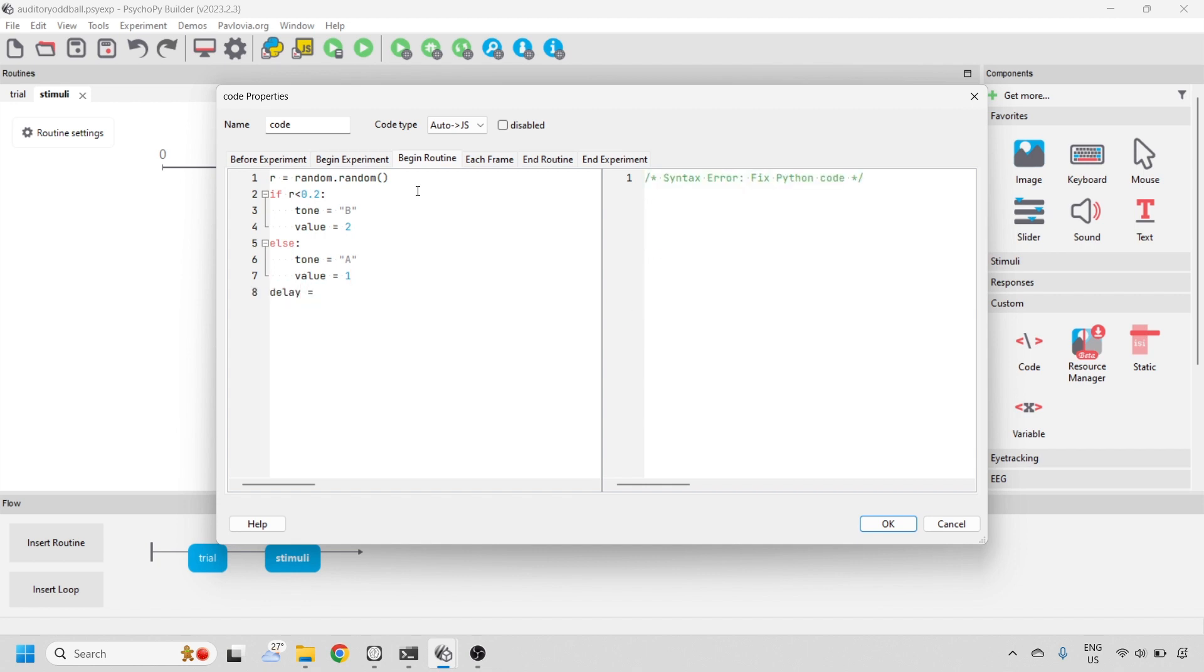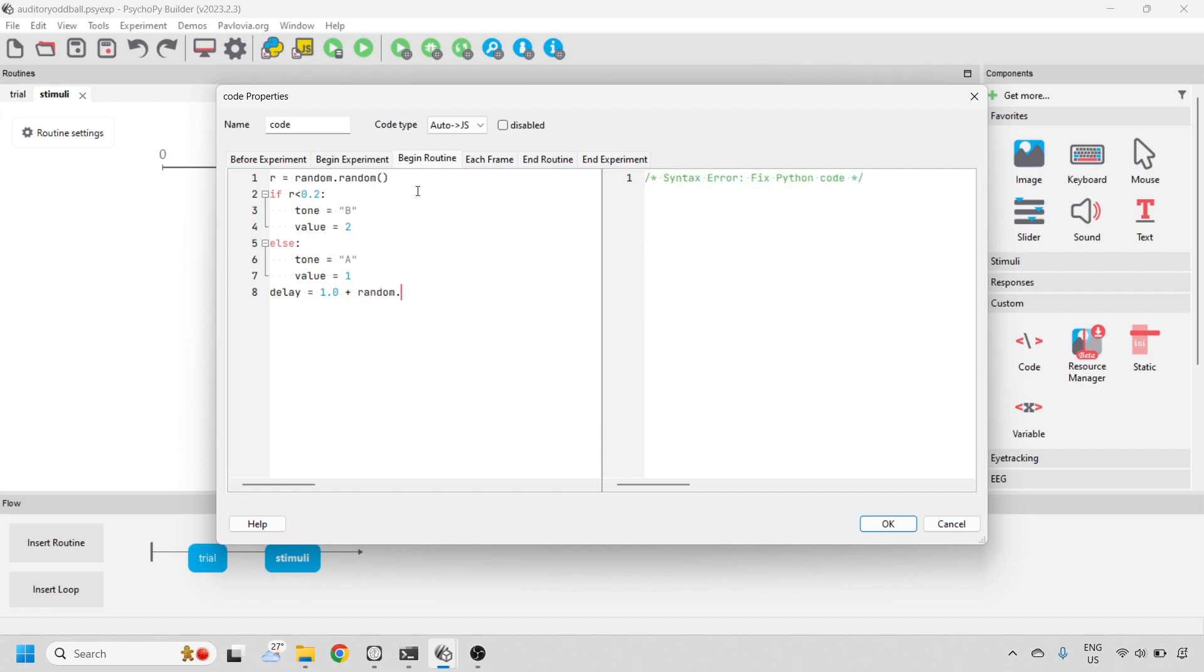We also want to define an inter-trial interval. We'll call that dollar delay, and we'll allow that to vary between 1 and 2 seconds.